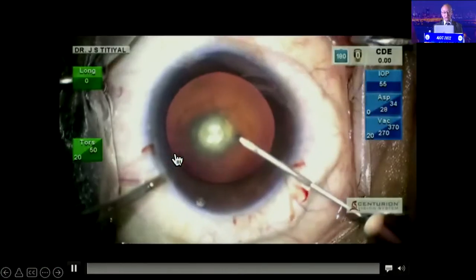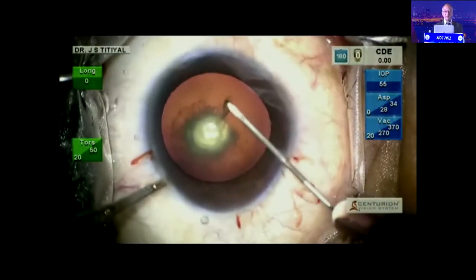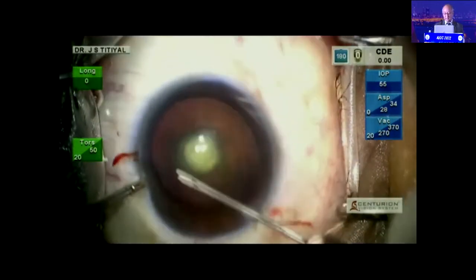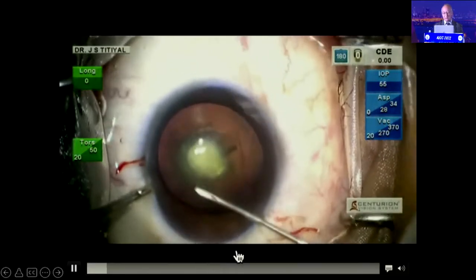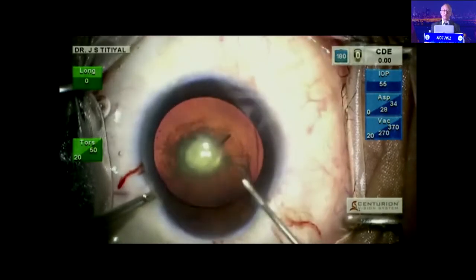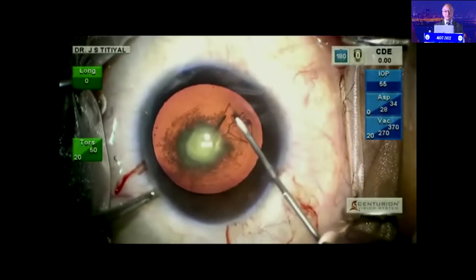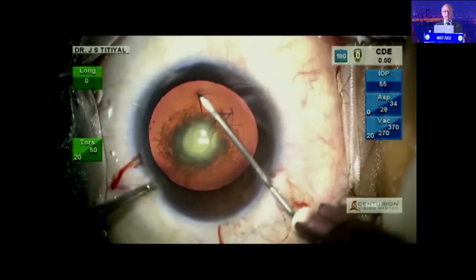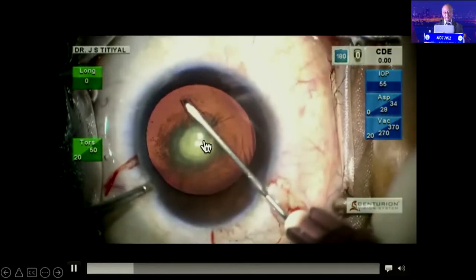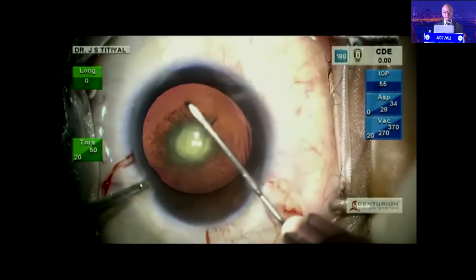So surgery-wise, you are all aware that surgery has to be thought simply and done simply, by making the rhexis size around 4.5 to 5 millimeter in these cases. And subsequently, if the posterior capsule gets damaged, you can put the lens on the anterior rhexis and get capture. That situation normally doesn't arise in all cases, but here you can see a classical posterior polar cataract, with the onion peel type of appearance or a bullseye pattern which is seen here.